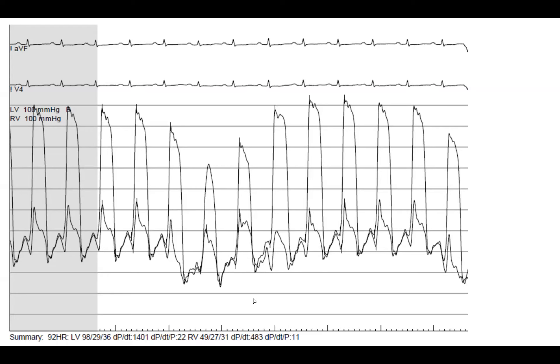You compare the pulse volume in inspiration versus expiration. The second important idea is that you need to find what is inspiration and what is expiration. The easiest way is to look at the diastolic dips. Peak inspiration corresponds to the lowest diastolic dip — the beat that follows it is the peak inspiratory beat. Then you look at the highest diastolic dip, which corresponds to expiration.